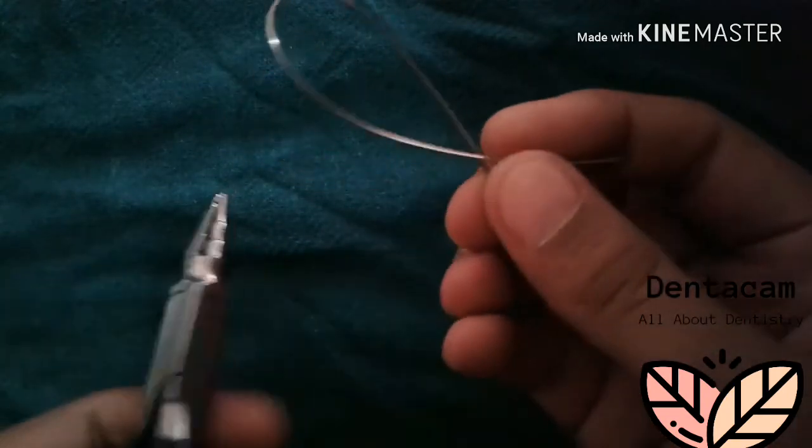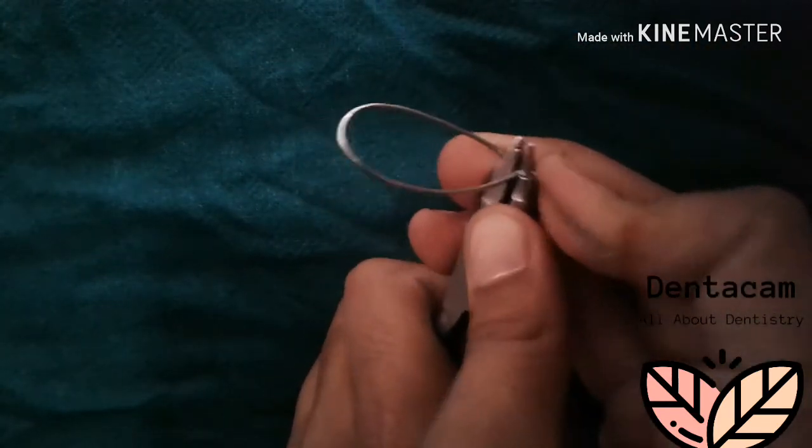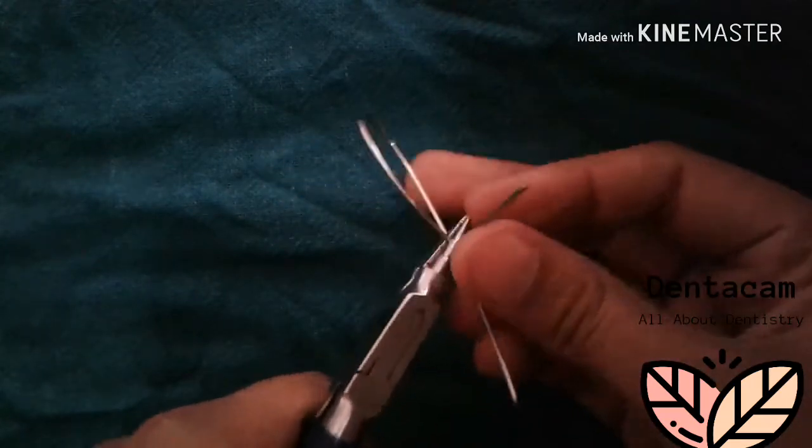Now, for the retentive arm, give a bend at an angle of about 30 degrees like this.